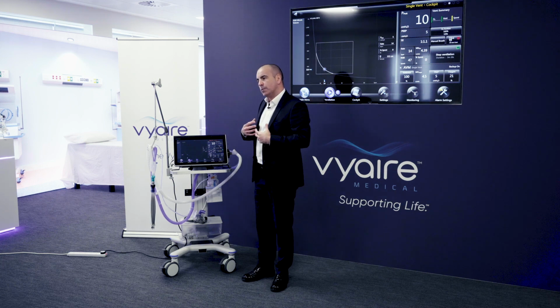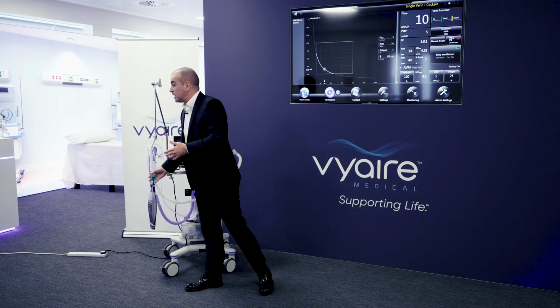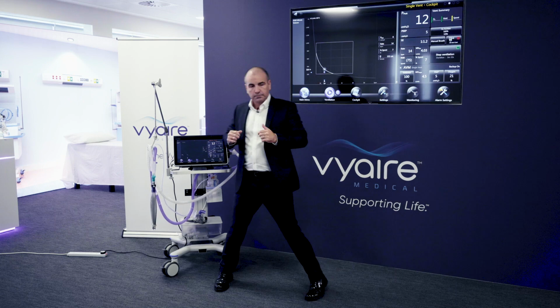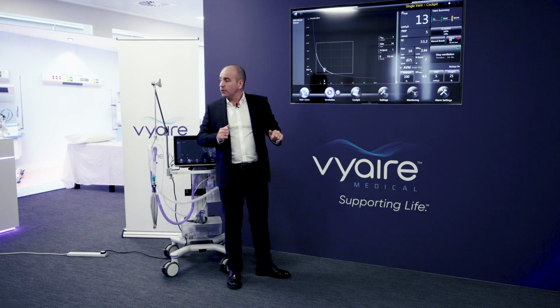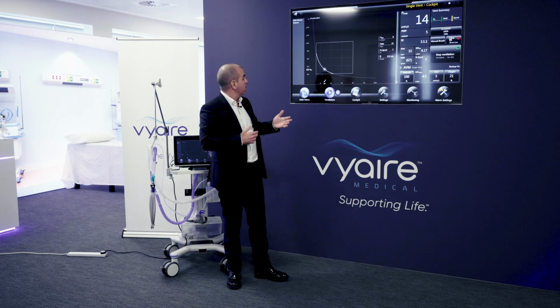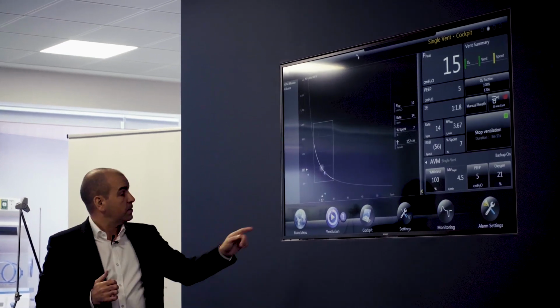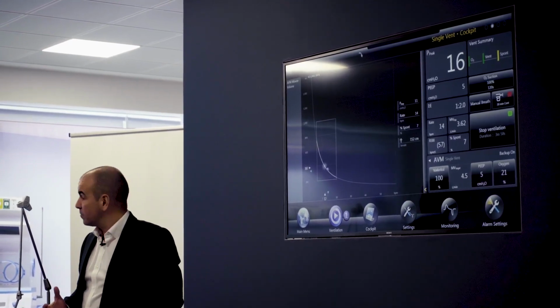But if something changes with the patient, so for instance, if I change the airway resistance, so if you have an asthmatic type patient and everything's tight, those patients need more time to breathe out. So you'll see on here, the shape will change. It will slow the rate down, and it will increase the volume, because having a slower rate is going to give a longer time for the patient to breathe out. So you end up with a more narrow and more vertical looking protective frame. So you see here the rate's dropping, the volume's increasing. And that's what we would expect, that's what the doctors would want.